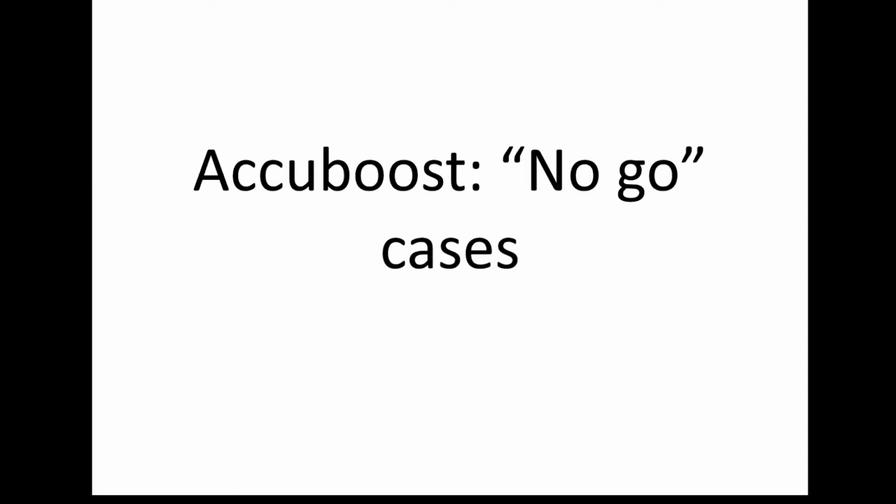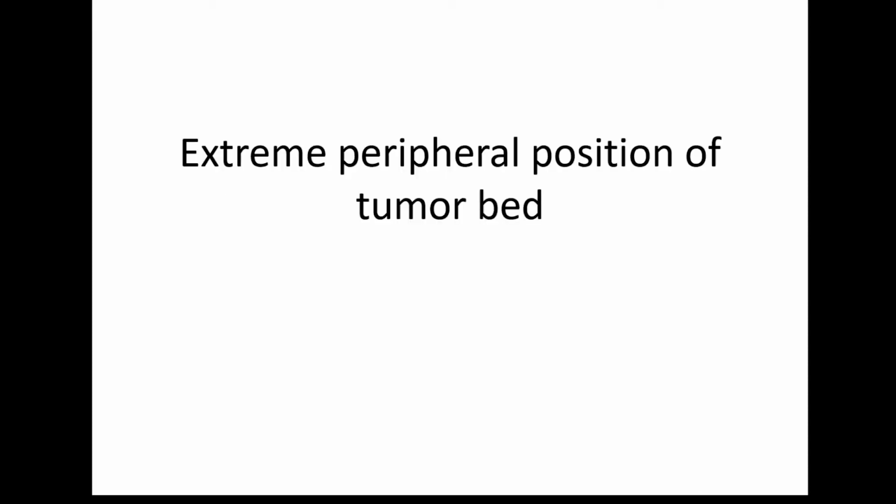What are the circumstances where we don't think AccuBoost is the most appropriate modality? I think that's an important question, and I want to give a few examples here that summarize those circumstances where we just don't think AccuBoost is the best choice. Next slide. Almost exclusively, these relate to having the extreme peripheral position in the breast of the tumor bed.